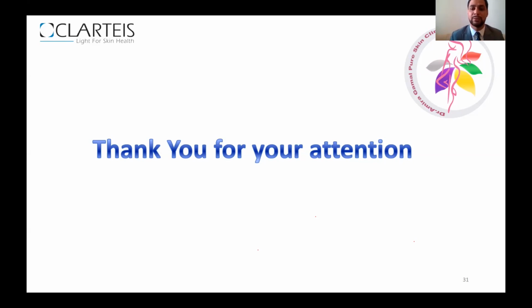Do you use eye shields while treating upper eyelids? Any protection for eyes? Yes, the Exciplex device itself has some shields. They come in different shapes. You use them to minimize the area which will take the light, and because they have different shapes, I use them before I make the session.